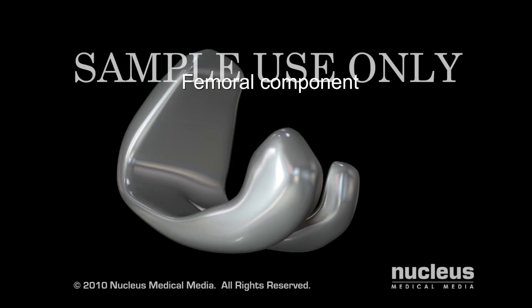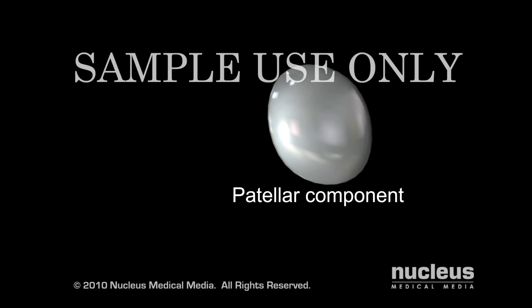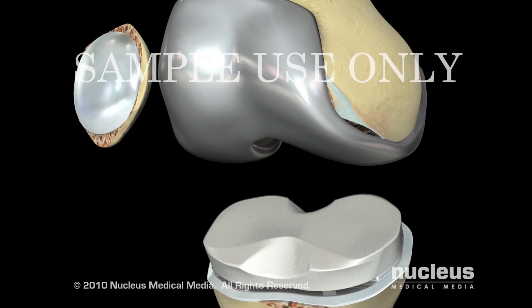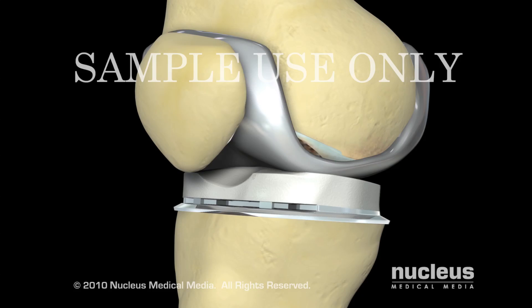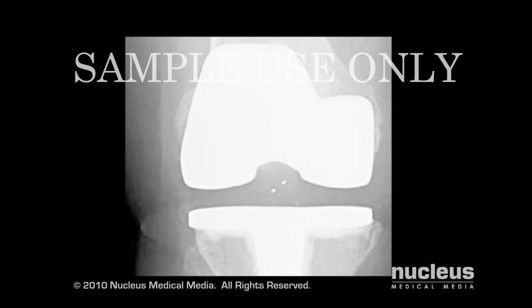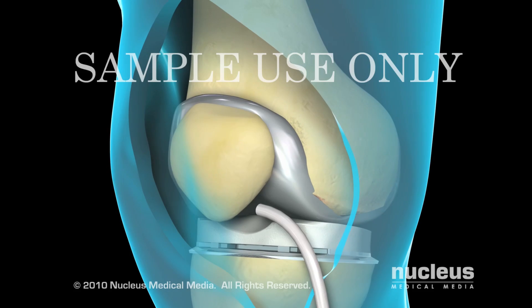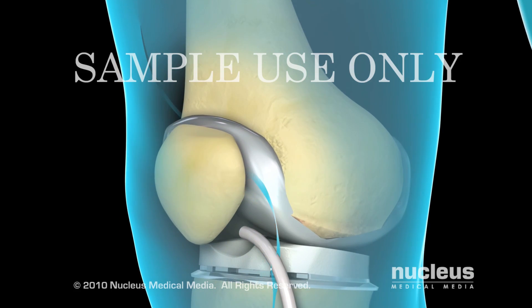The prosthetic knee generally consists of a femoral, a tibial, and a patellar component. Once the ends of the bones are prepared, your surgeon will cement the new prosthesis into position. Before your incision is closed, an x-ray will be taken to ensure that the new components of your knee are positioned correctly. Your surgeon will close the incision with stitches or staples, and temporarily leave a drain in place to remove excess fluid.